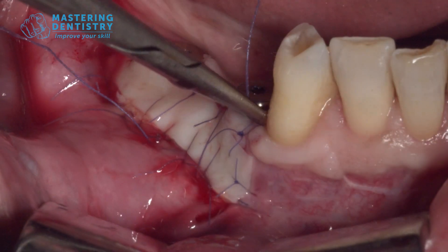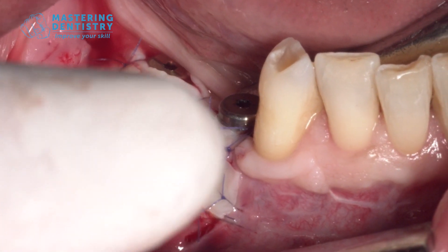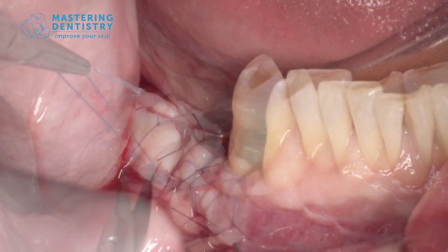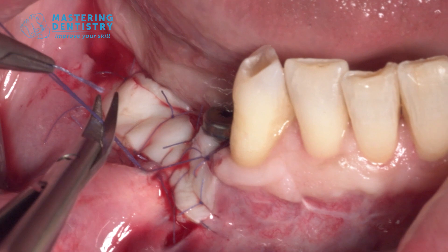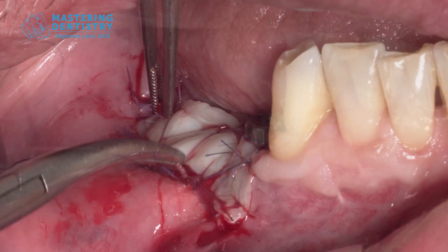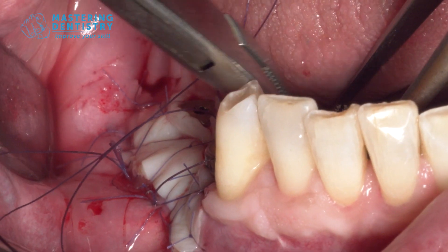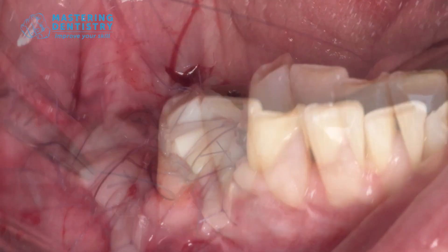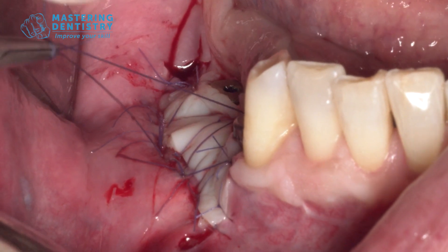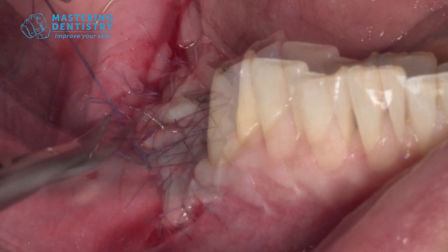We start from distal — the two apical points — with the first exit point in the mesio-apical region. Then we go around the healing screw, cross the suture, and tie the knot, pushing down the graft toward the periosteum. In between the two healing screws, we can anchor the sling suture to the lingual tissue we have not raised in the first phase.